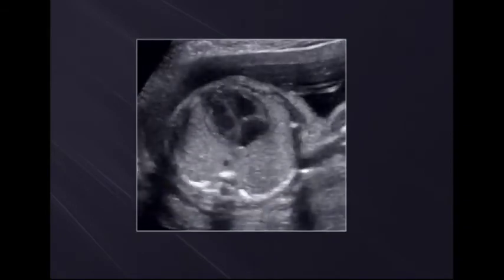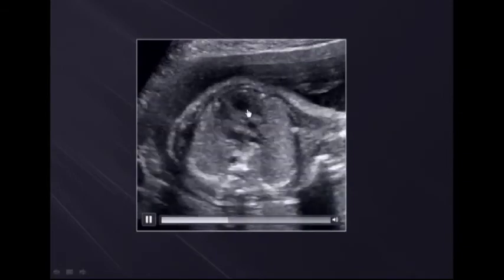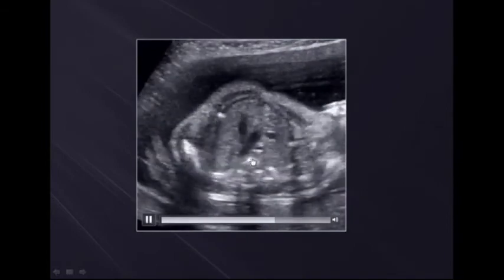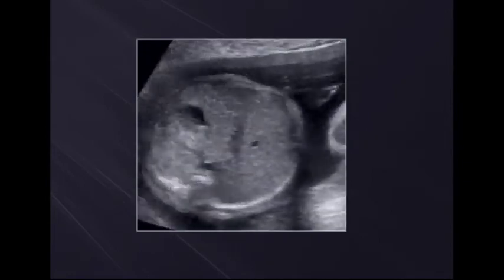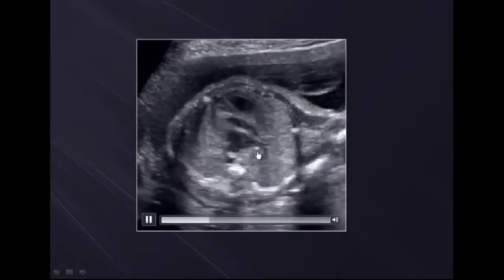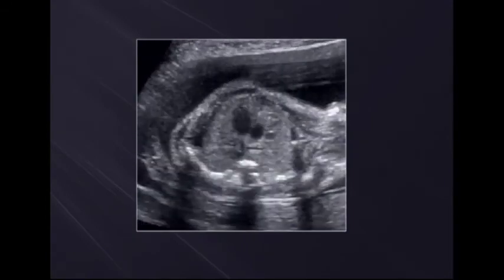Then as they come up from there, you can see in real time the RVOT goes down to the region of the ductus, and then you have the LVOT. If you look carefully, just adjacent to the aorta, you can see a little teeny structure, and that little teeny structure right there is going to be the trachea, and the trachea you can actually see bifurcate in this view.